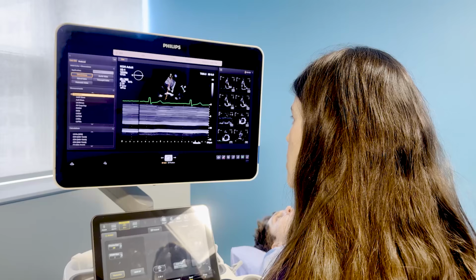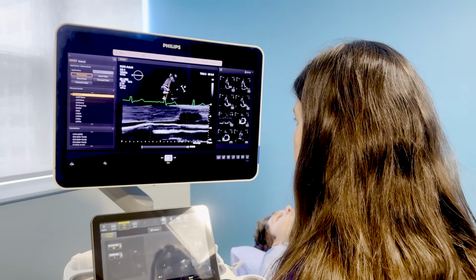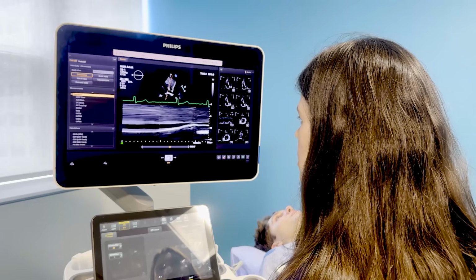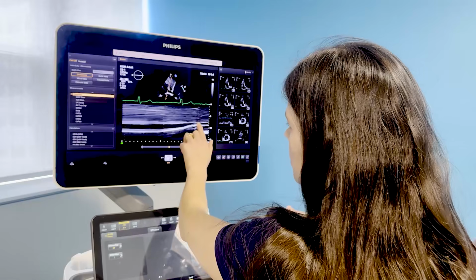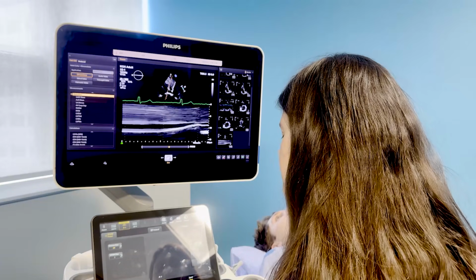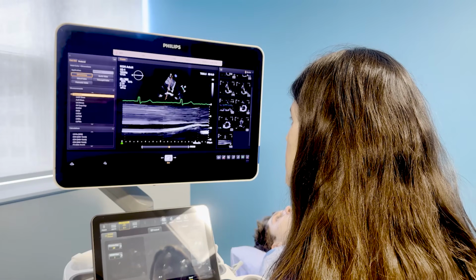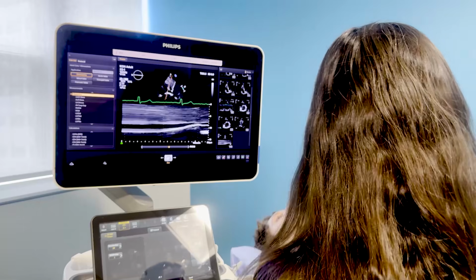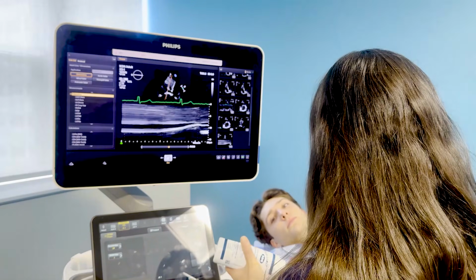Take a big breath in for me, Mateo. Big sniff through your nose. Good. And then just breathe normally. That really shows it nicely. So you can also use M mode to appreciate that as well. Okay, great. And then you can just measure it right here. And I think the last thing, if you can show us today, is how you interrogate the pulmonary valve for pulmonary regurgitation, which may also occur in patients with pulmonary hypertension.